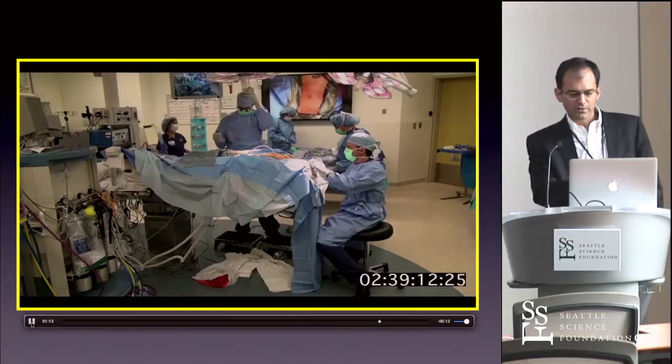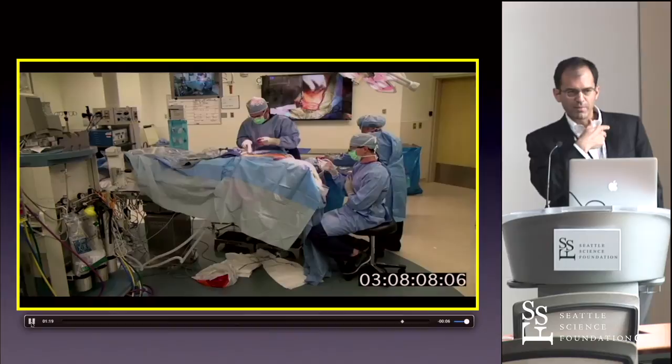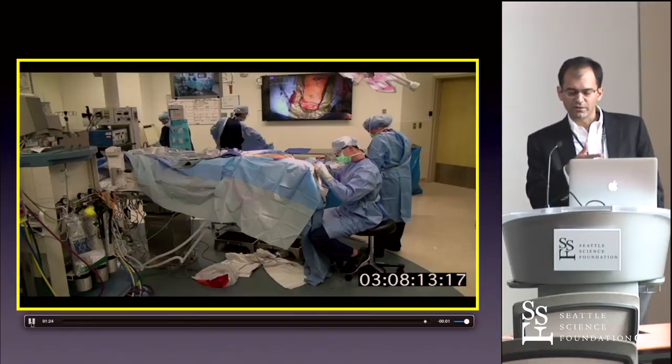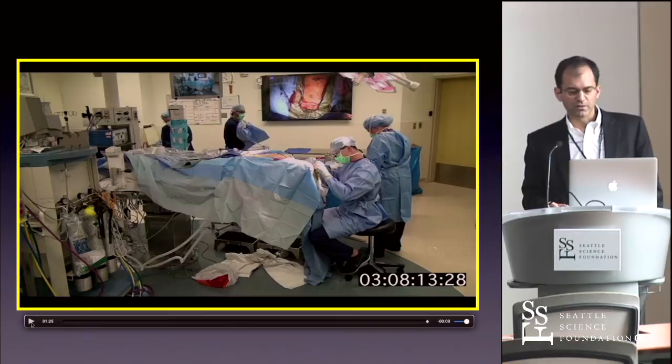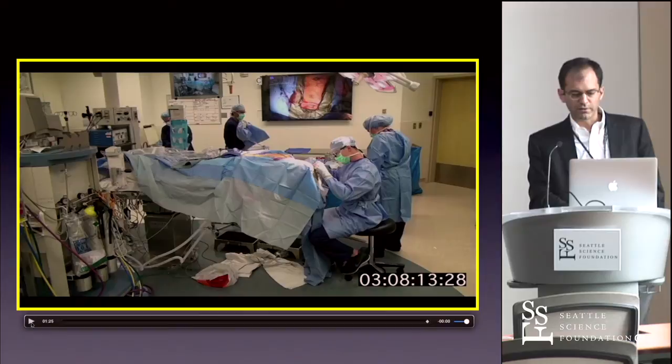We bring in the scanner and make sure we like what we see. Looking at the CT scan, you can see all four contacts. It's been about two hours and 40 minutes into the procedure, and now we're doing the battery. We can do both sides and the battery in the morning and again in the afternoon. Patients just go in once, go to sleep, wake up, and everything's implanted. Traditionally in the United States, DBS is done in multiple stages, largely for reasons of hospital reimbursement.